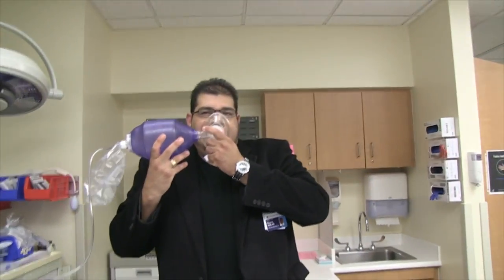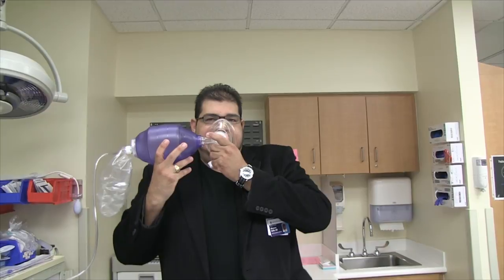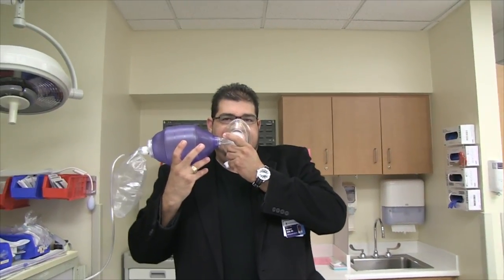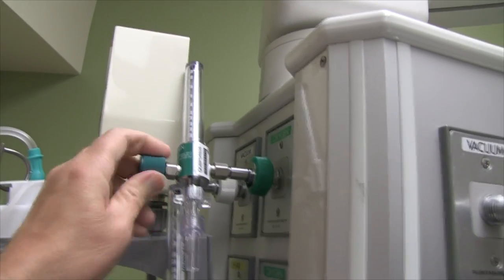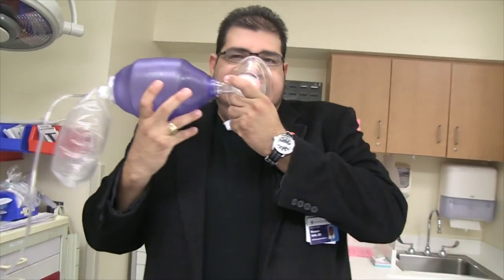See, the bag is basically collapsing. He's overwhelming that system. But if I take this and crank it up to 50 or 60, whatever our endpoint is. All right, now.